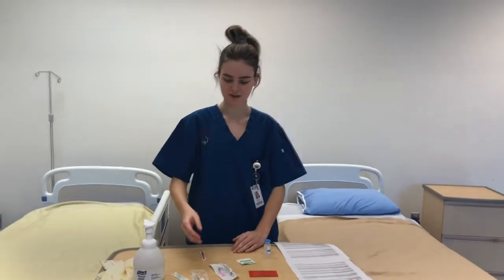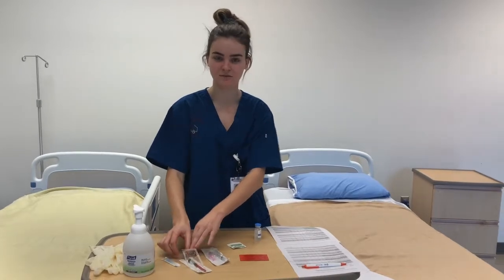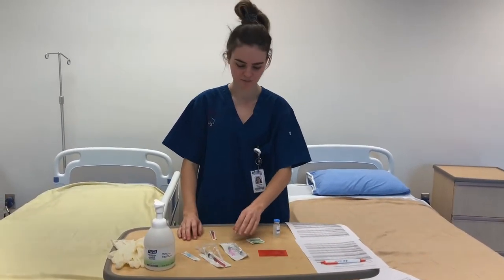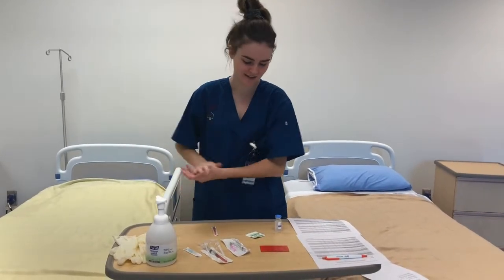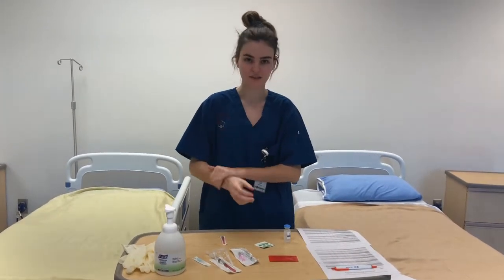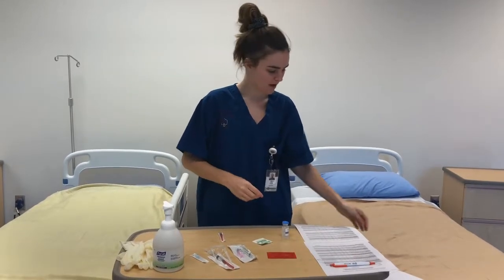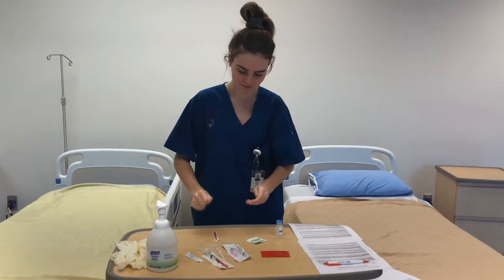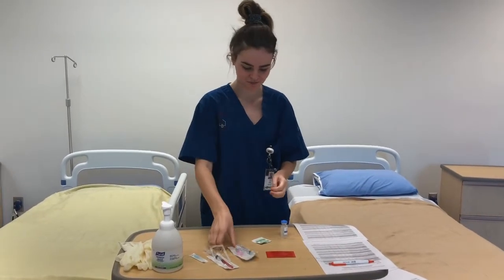Okay, so now that we've got the subcutaneous syringe ready for injection, we're going to get the IM syringe ready for injection. So first I'm going to perform hand hygiene, and we're going to be using a 3 milliliter syringe, filling it up with 0.5 milliliters of the Haldol, which is going to be given IM. And we're going to be using a 21 gauge needle.